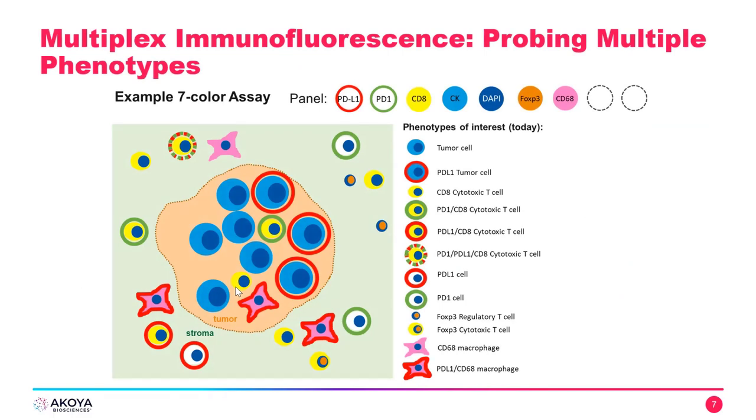This caricature depicts a 7 multiplex assay and how cells are interacting with one another, more specifically an immune infiltrating response. Multispectral images can allow us to see these interactions. The higher you plex, the more information you're going to get.